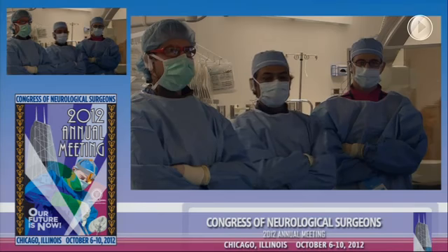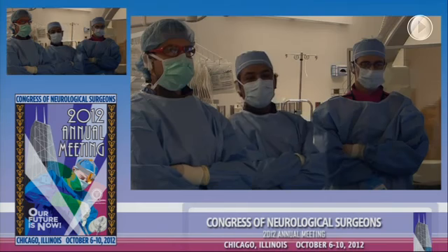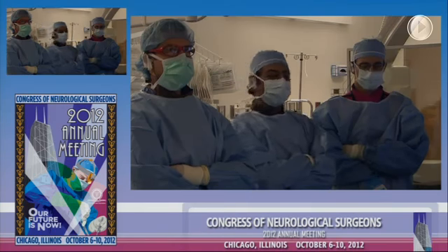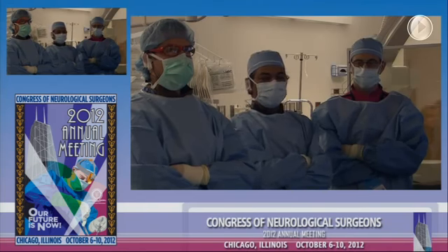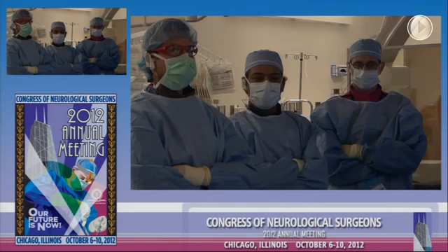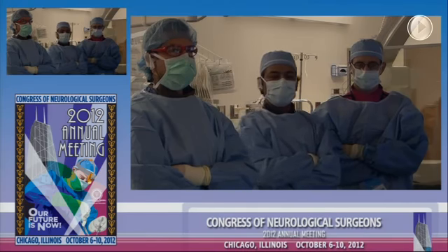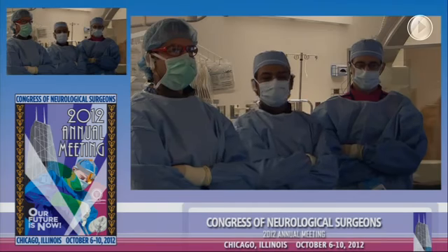And with flow diversion, one other concern that we have had in terms of packing coil mass opposed to the optic nerve, as you saw in Alad's first case, is really avoided. And so you're reconstructing the vessel pretty much the same way as you would microsurgically, only you're endoluminally reconstructing the vessel rather than exoluminally with a clip.